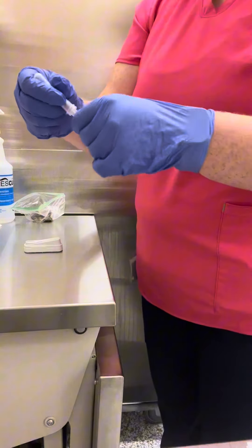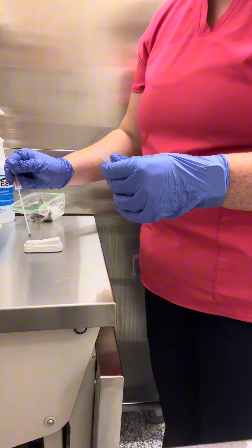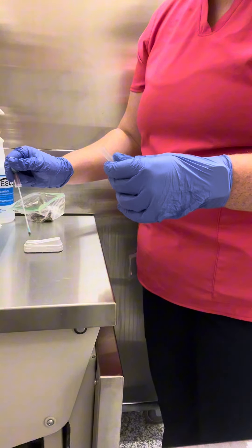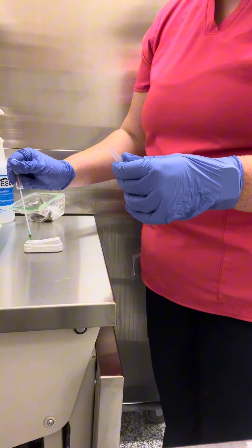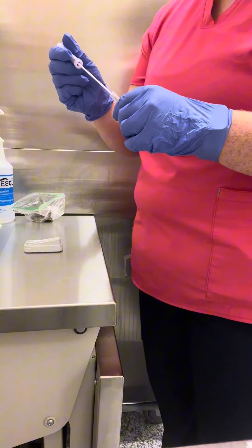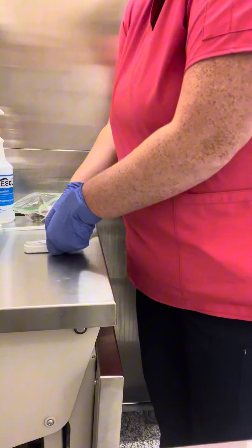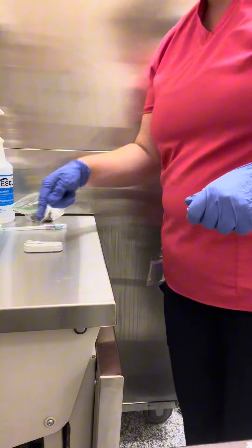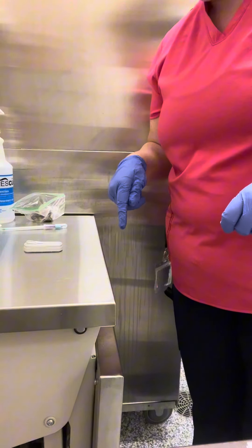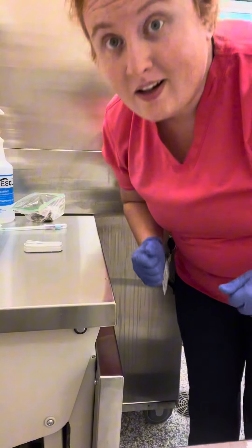And as a dropper, not touching the device — one, two, three, four, five drops on my sample. And I push down immediately as I see it start to filtrate on the paper. And now we wait eight minutes.